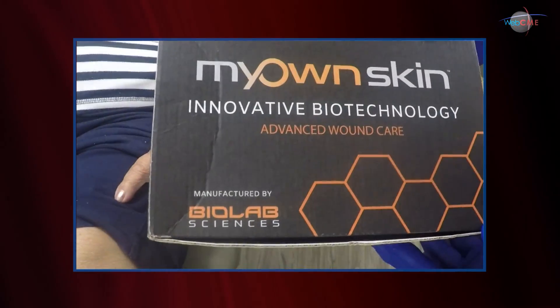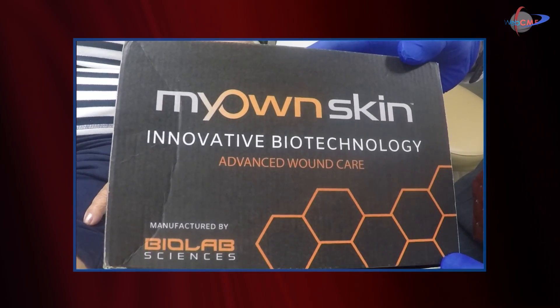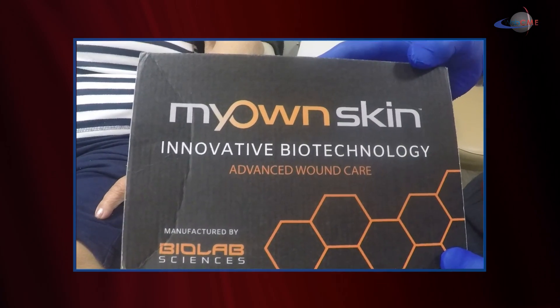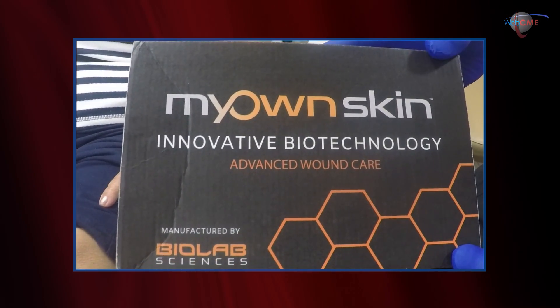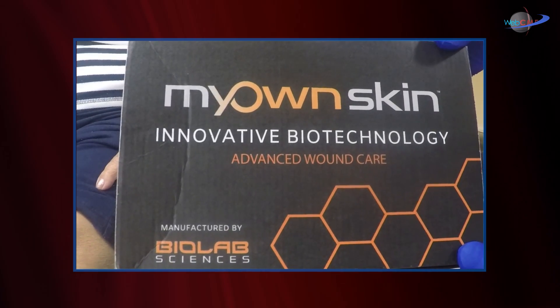I'd like to introduce you to a new technology. This is the first time I'm doing it, so we're going to learn together. It's a technology called My Own Skin by Biolab Sciences — an advanced wound care technology where we're going to create a graft utilizing the patient's own skin and blood. Samples will be sent to the lab, expanded and grown, and then we'll show you the application of that product to the patient's wound.